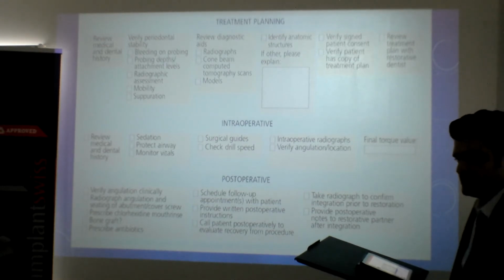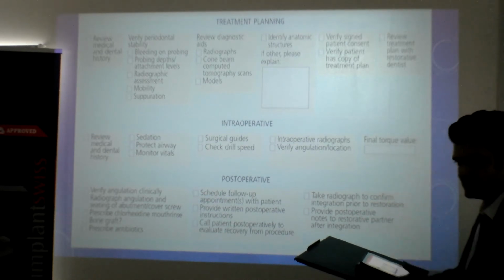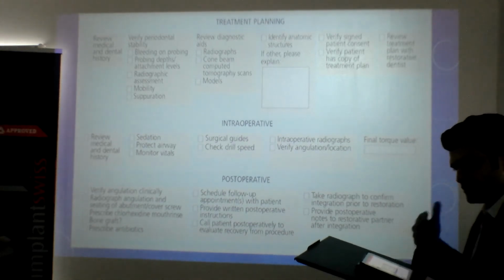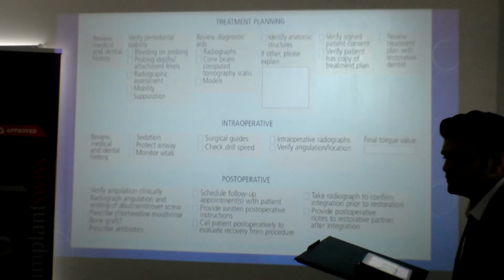Slow speeds are becoming more popular, and they tend to make sense. How you're going to handle them depends on your surgical skills. Or you can just follow the manual, which means start from 1000, then 500 or 400 and 300. You can do all that if you like. But be aware that nowadays the trend is towards almost 50 RPM or less, or just about that. And it works. So something to be aware of.